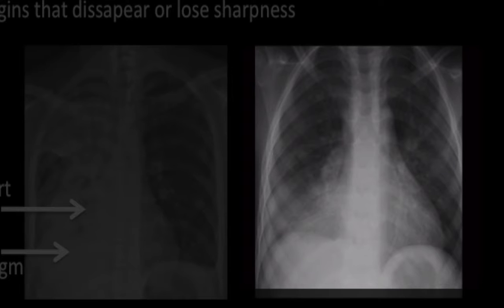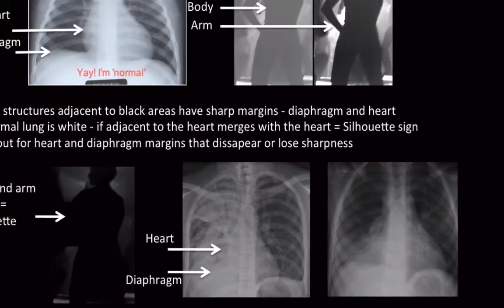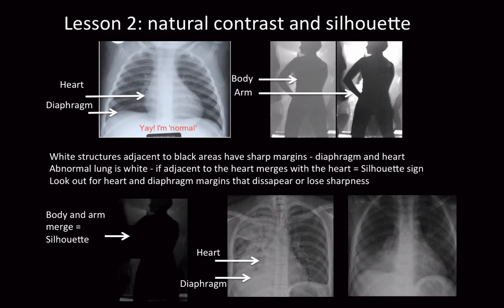So the lesson is this: if the cardiac margin is indistinct, irregular, or missing, that means there's adjacent disease in the lung — this is the silhouette sign. Always look at the cardiac margins and the diaphragms and be sure you can draw with a pencil the outline throughout their entire length.